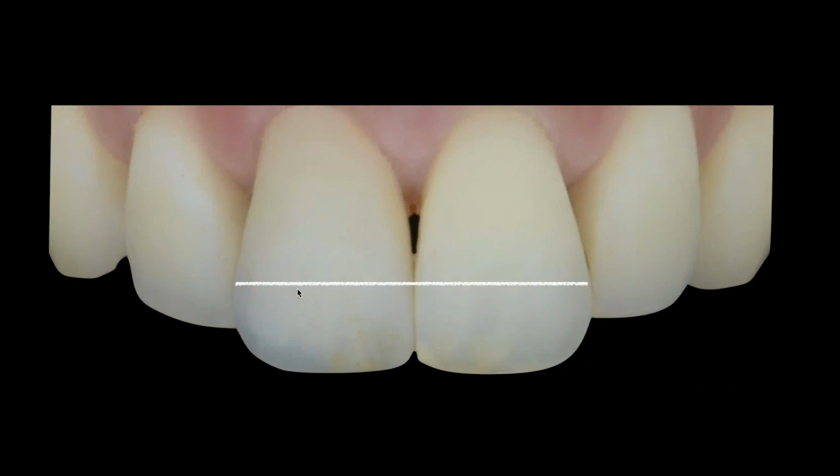Is the color perfect? If I photograph this under polarized, you should see that I'm not perfect. I'm close, right? I'd say there's maybe a hair too low in value and maybe a touch too much chroma on the cervical. The value in the middle third is pretty good, and I think that's what makes it a home run. Could I be a hair brighter? Yeah, I'm sure if I put it under my OptiShade or one of my devices, I could check. I'm sure I'm off by a few points, but not really noticeable unless we're analyzing it in that way. And the incisal third is really the fun part, right? It doesn't have to be perfect. It just has to have some similarities to it, and we did that.